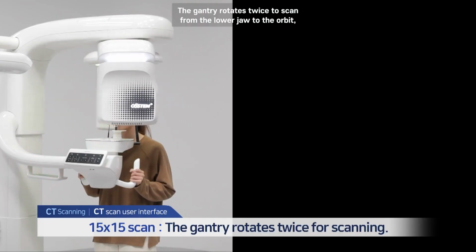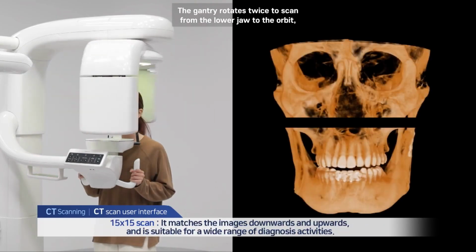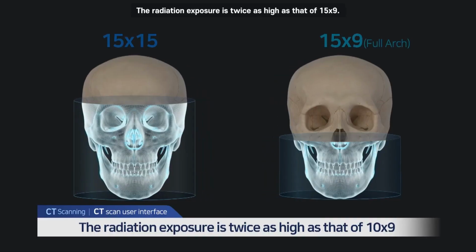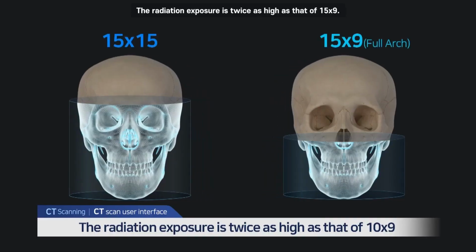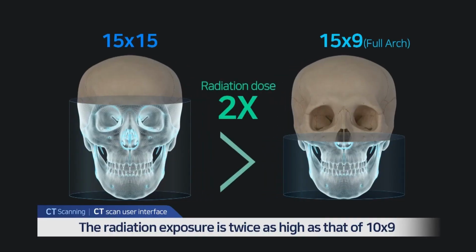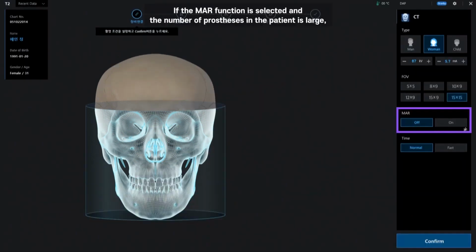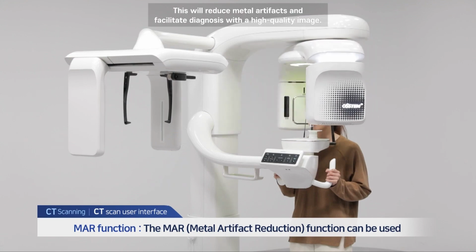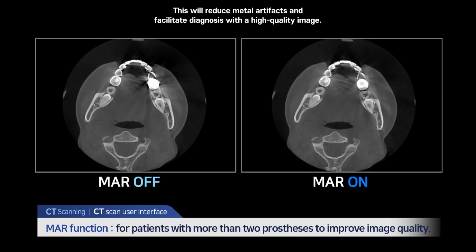The gantry rotates twice to scan from the lower jaw to the orbit, which is useful for a wide range of diagnosis activities. The radiation exposure is twice as high as that of 15x9. If the MAR function is selected and the number of prostheses in the patient is large, this will reduce metal artifacts and facilitate diagnosis with a high-quality image.